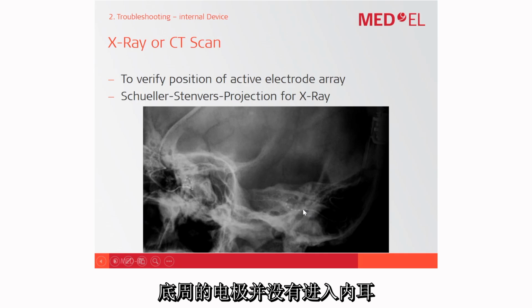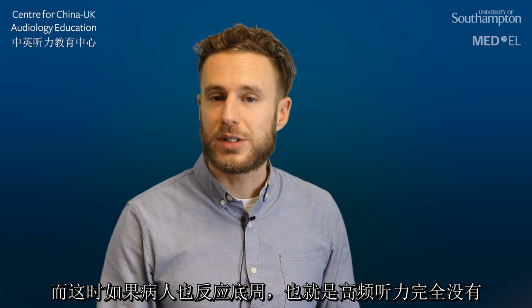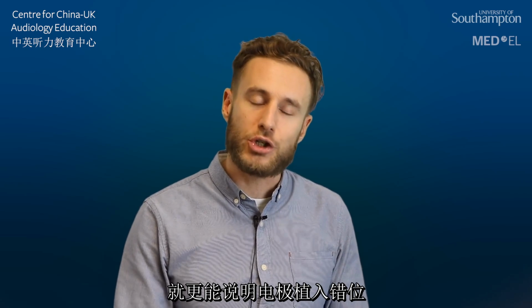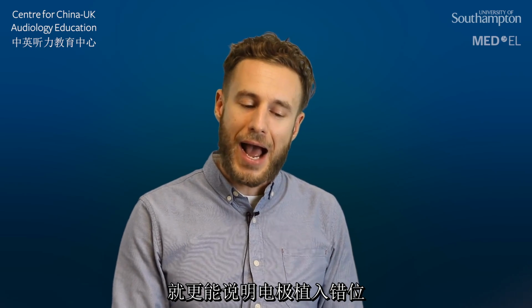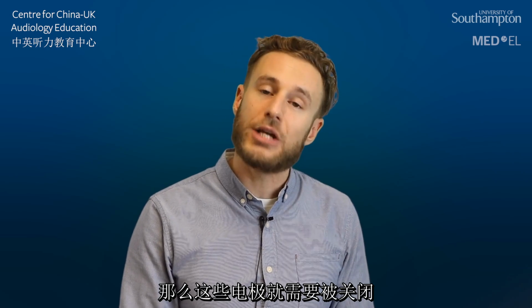So especially these basal channels are not in the inner ear. And if the patient reports no auditory perception, we could assume that the electrode migrated out of the cochlea. In such a case, these electrodes need to be deactivated.